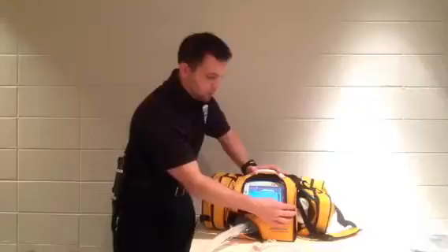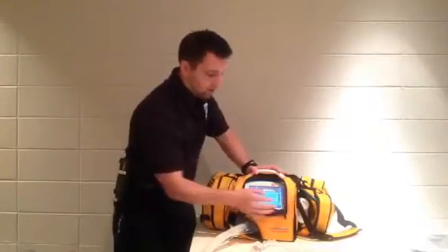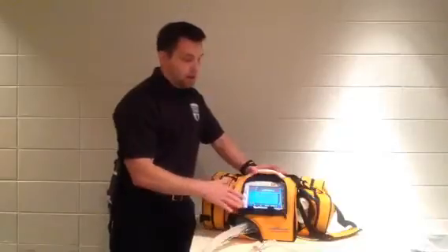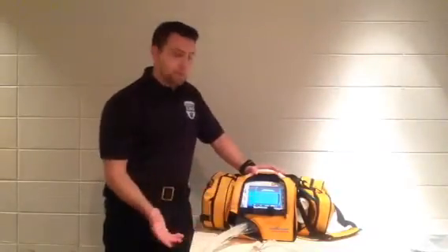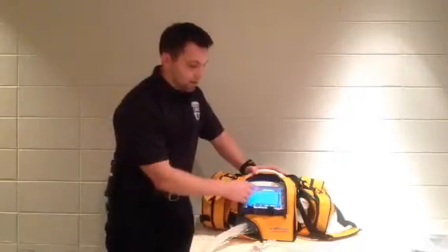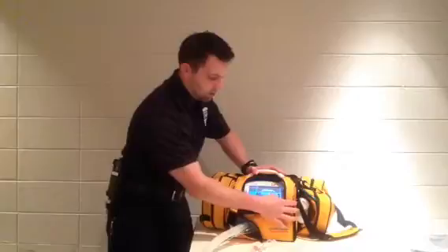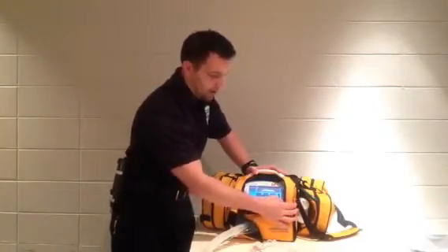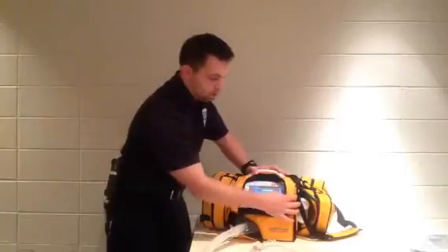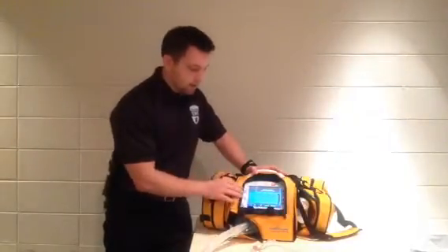If I'm going to change my respiratory rate down to 12 and hit accept, I can also change multiple parameters at once. Say tidal volume is 500, respiratory rate is 14, and PEEP is 10. I can go here: tidal volume, move it to 500; respiratory rate, move it to 14; PEEP, move it to 10. Now all three have been changed — hit accept and it takes all three at the same time. So that's a nice aspect.